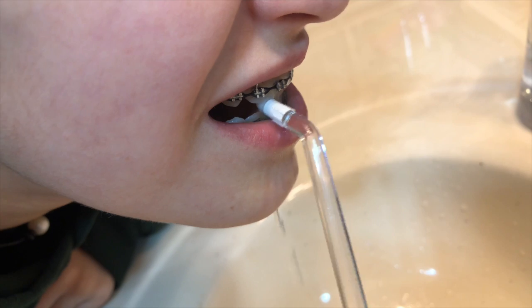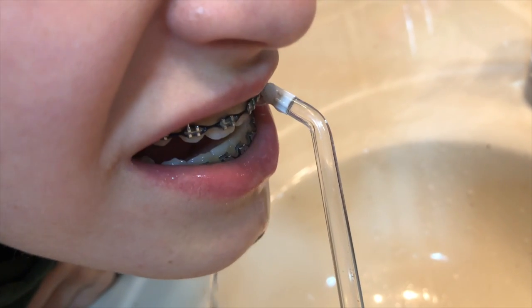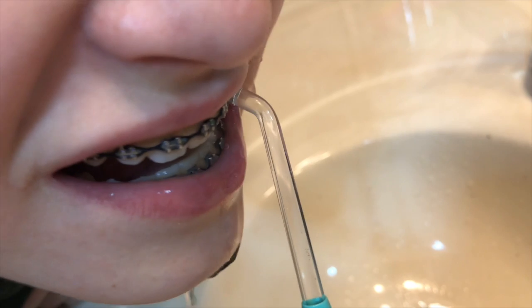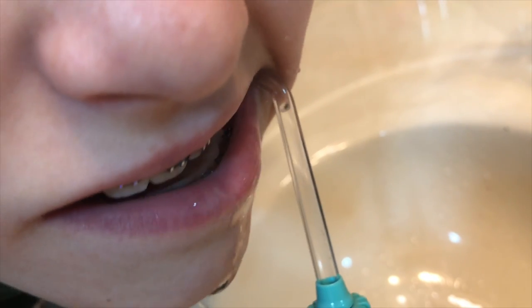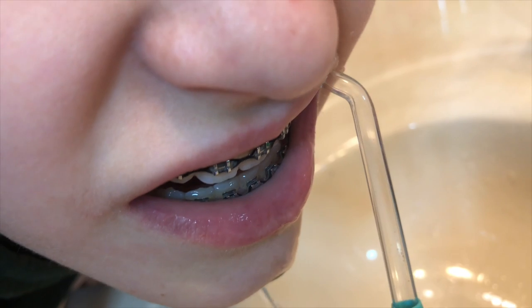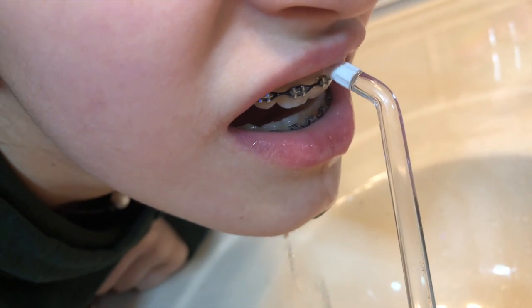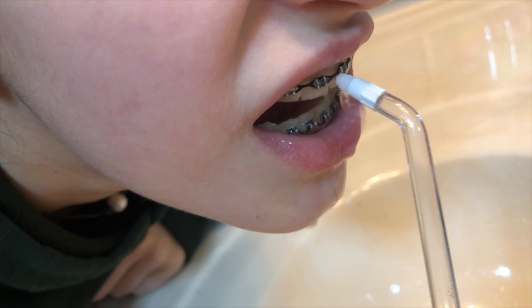That gives enough space between where the water comes out and the tooth, because the bristles are there, but it helps you feel your way along. And then when your child goes to use it themselves, you can say, hey, just put the bristles right along, trace those M's, trace those W's, and then rub it a little bit in between the teeth. And I think you'll be amazed.